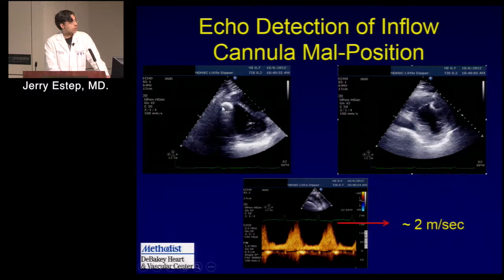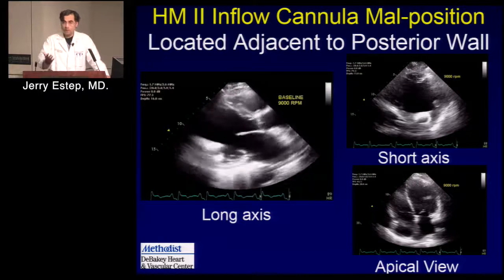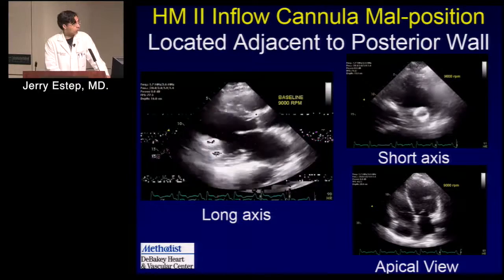So here by the modified parasternal, very close to the septum, when you look at the short axis, remember anterior, posterior, instead of being right in the middle, this is very anterior. And look at the velocity signals that we're getting. Again, more than that 1.5. Now, this may be workable for an individual patient, but they're going to be very preload dependent. They may have frequent low flow alarms.